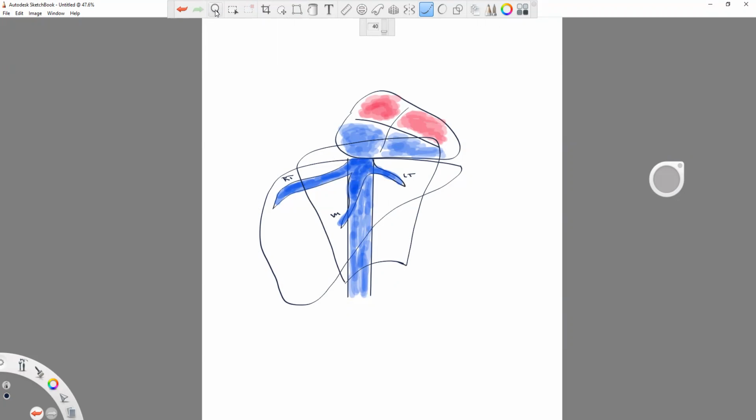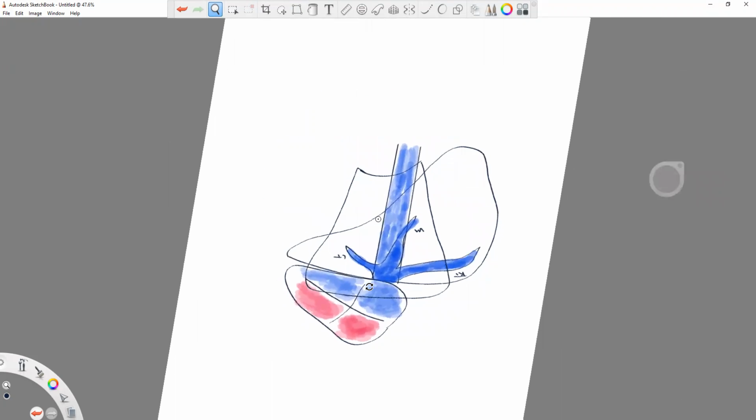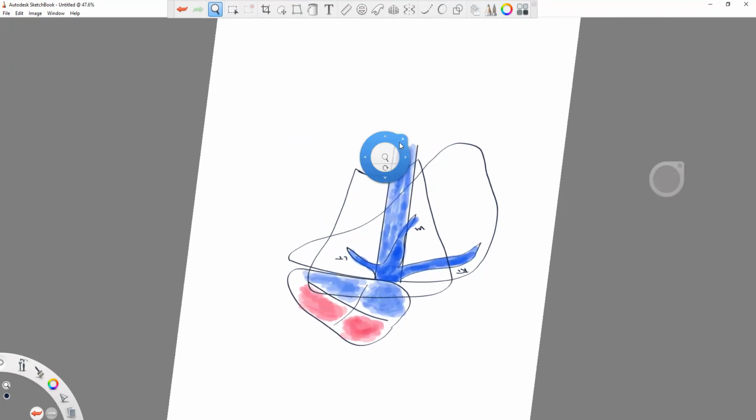So we can start to think about it like this. We're seeing it upside down. So if I turn it like this, now I have what's on our screen. The only problem is by turning it that way, I do now have the hepatic veins coming up from the bottom of our screen. See, because we've turned everything upside down. This is how we're actually going to view it. But this isn't accurate. Why is it not accurate?